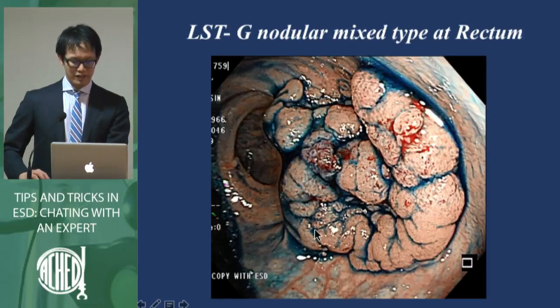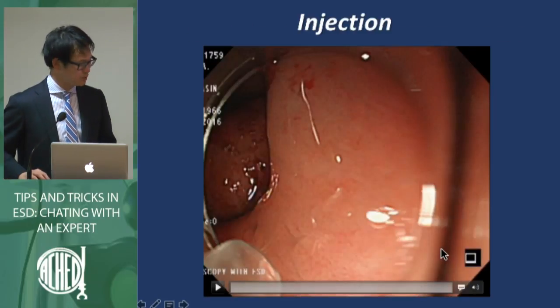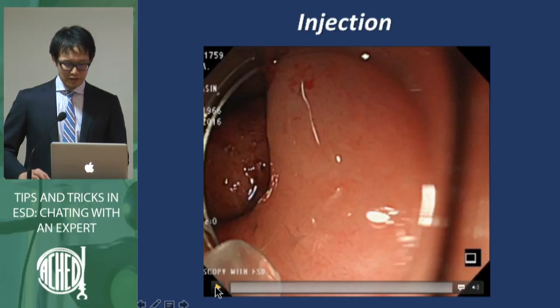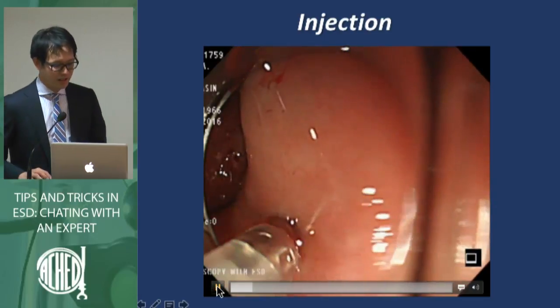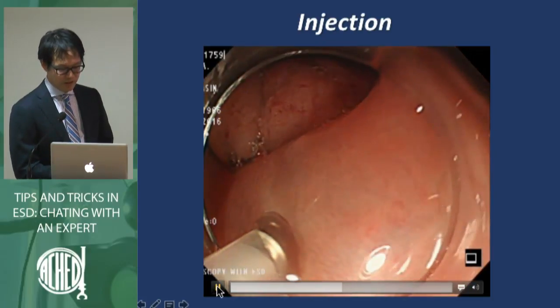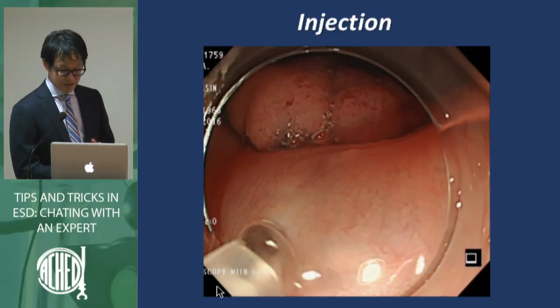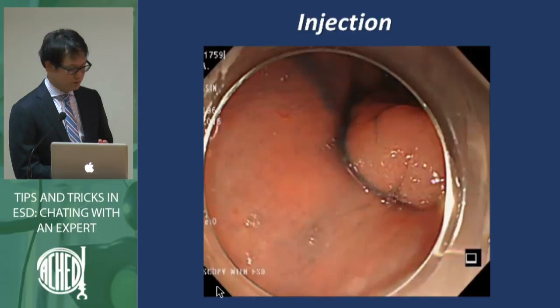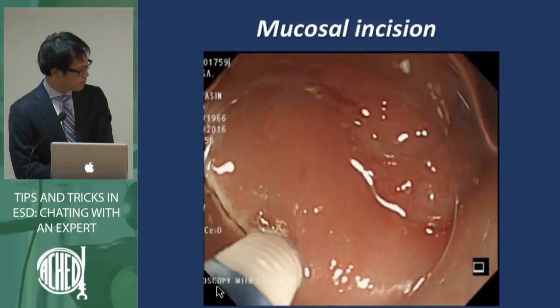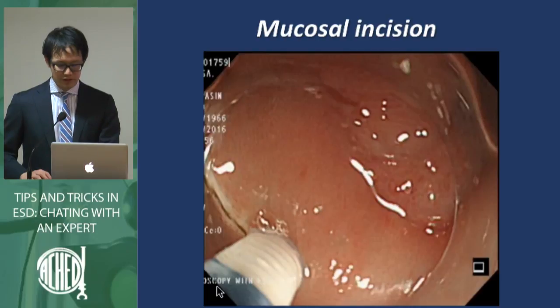I would like to show the ESD procedures, how to do them. Initially we inject into the submucosal layer. We usually inject hyaluronic acid surrounding the lesion into the submucosal layer using a needle. The second step is cutting the mucosa surrounding the lesion, the mucosal incision.